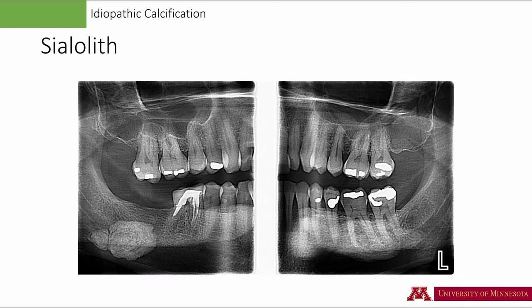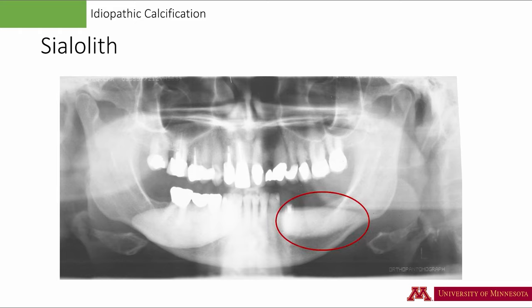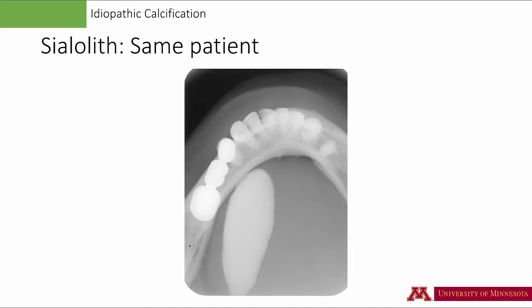On this extraoral bitewing radiograph, two sialoliths are present on the right side — the margins are smooth and the internal content shows multiple layers. On the right side, we have a large uniformly dense sialolith extending from the area of the premolars to the area of the second molars. The fuzzy radiopacity superimposed over the left posterior mandible is a ghost image. You may also identify a calcified carotid atheroma plaque on the left side. The cross-sectional occlusal radiograph shows the massive sialolith on the right side — the outline is smooth, the elongated shape conforms to the shape of a salivary duct, and this is completely radiopaque without any evidence of layering.